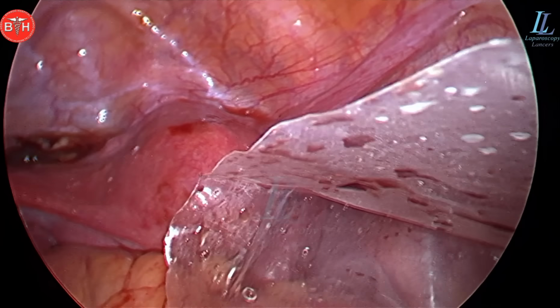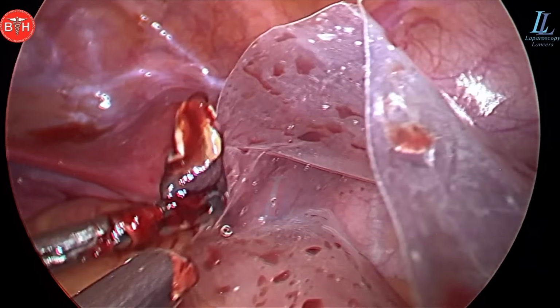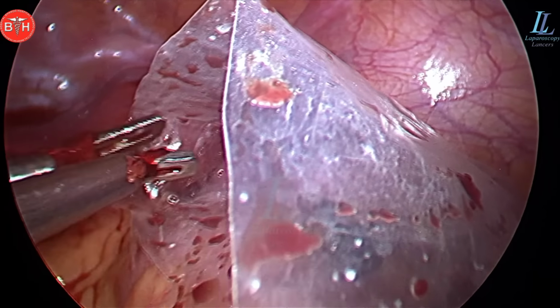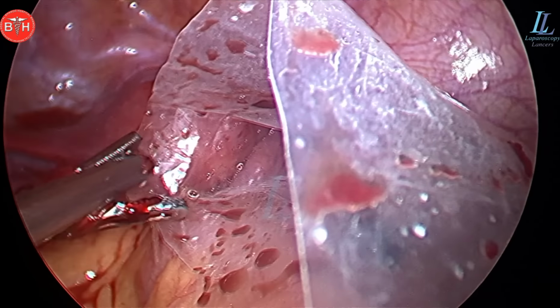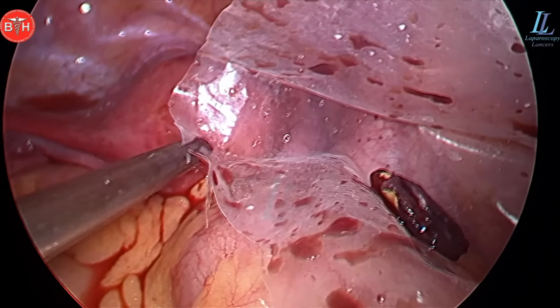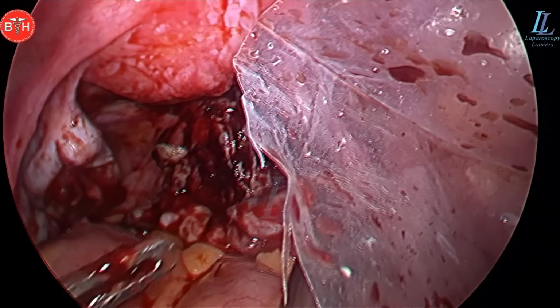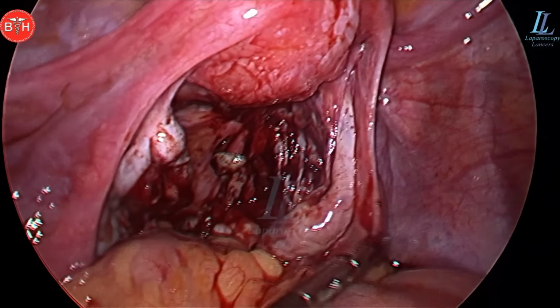And there the surgery is complete. Look, a piece remained over there. You should inspect everything, and that also goes in. There you can see, sucking out all the tissues and sucking out even the tissues over the grasper. Your surgical hand should be so good that it should feel as if your hands are inside.